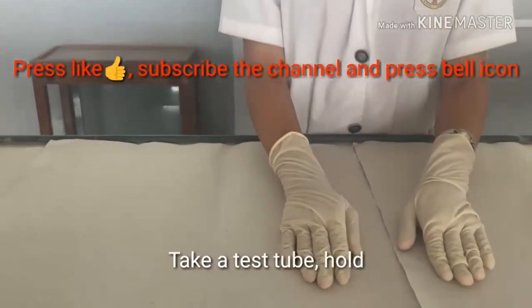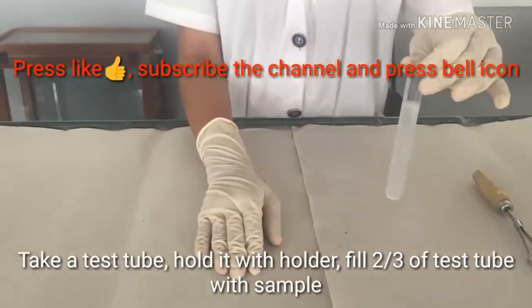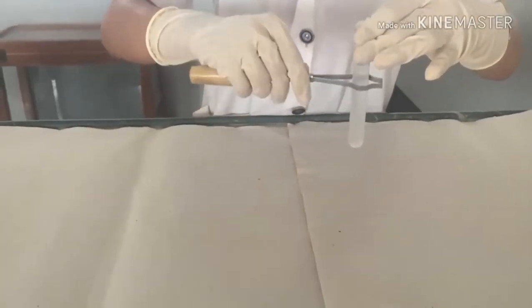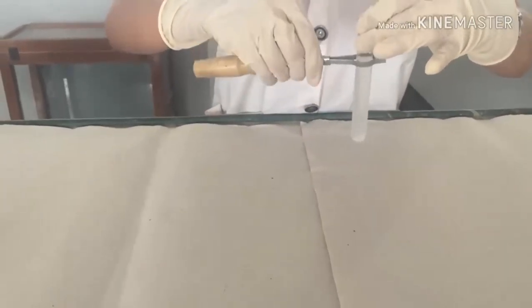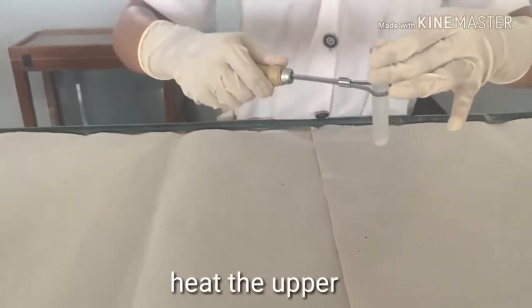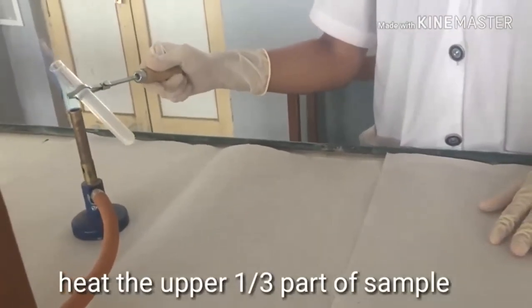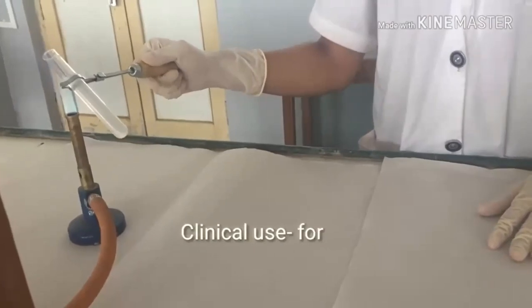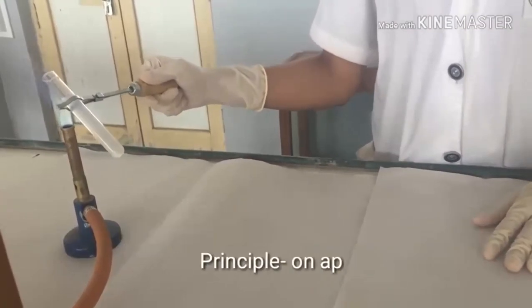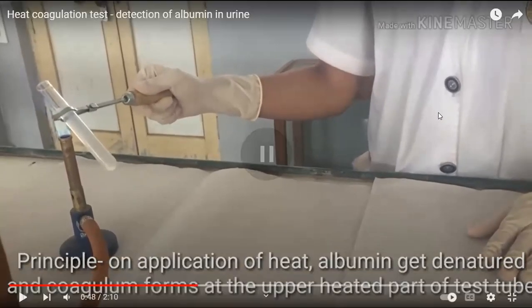We are going to perform the heat coagulation test. Take a test tube and fill 2/3 part with the urine sample and hold the test tube firmly with the test tube holder. Heat the upper 1/3 part. Let's go on to the next one.